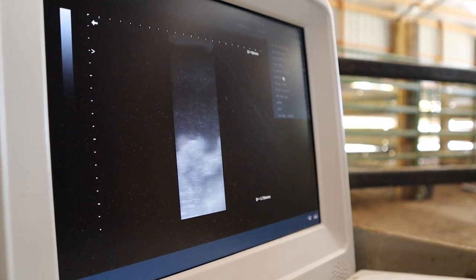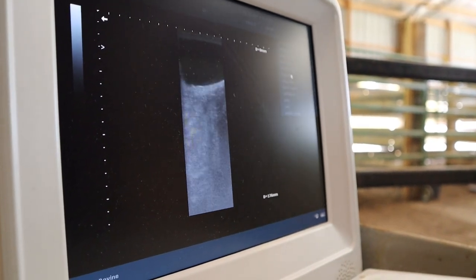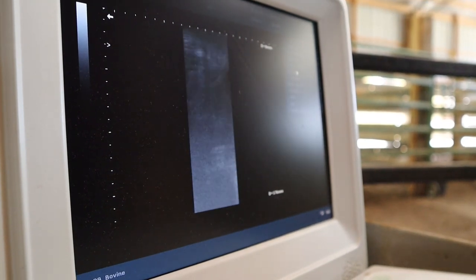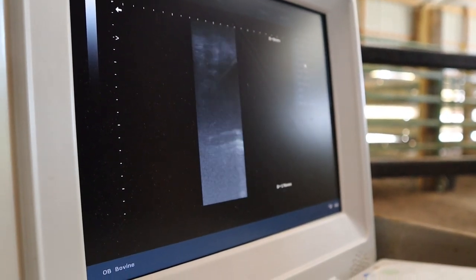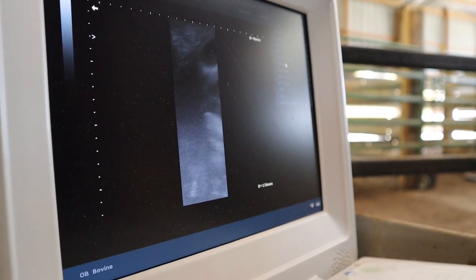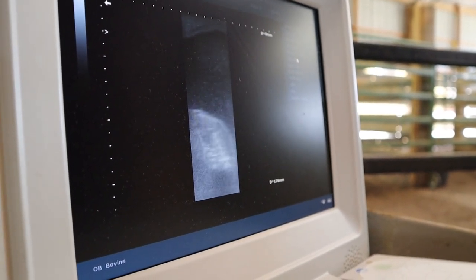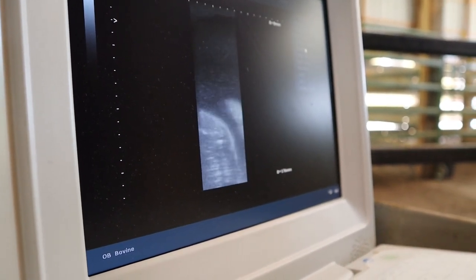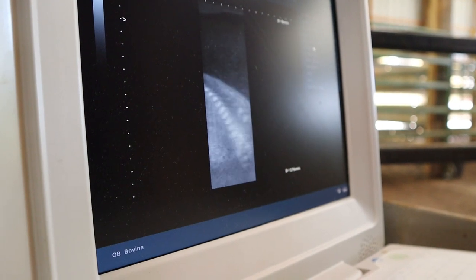The fetus. Oh, and I got that idea. Was nice. I saw the little edge of it. You see the edge of it? I did catch it on camera, and I might be able to stop that and take a still photo. There's some of the skeleton right there. Oh, yes. At the bottom. Yep. You see it? Uh-huh. It looks like a rib cage and a spine.